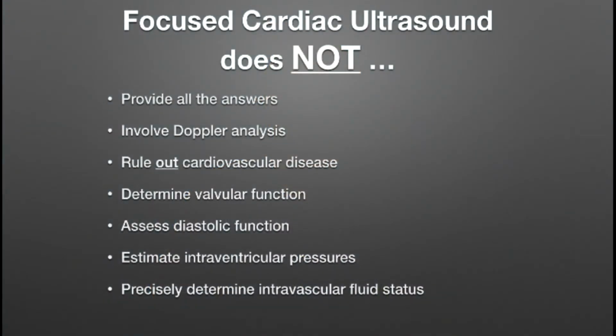Focused cardiac ultrasound does not provide all the answers, unfortunately. I think when I started off learning about ultrasound, I thought it was going to be the answer to everything. And some of my diagnostic uncertainties were going to disappear forever. And unfortunately, that's simply just not the case. Anyone who's examined a critically ill patient would know they're extremely complex, and ultrasound is not going to answer every question that you have about them.